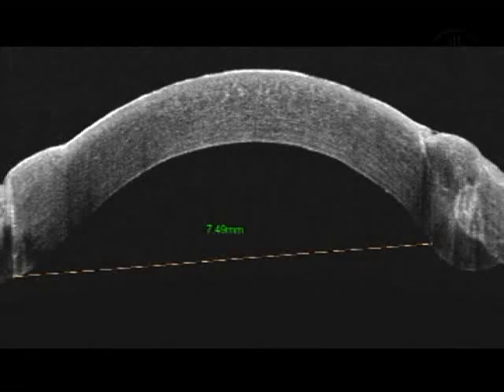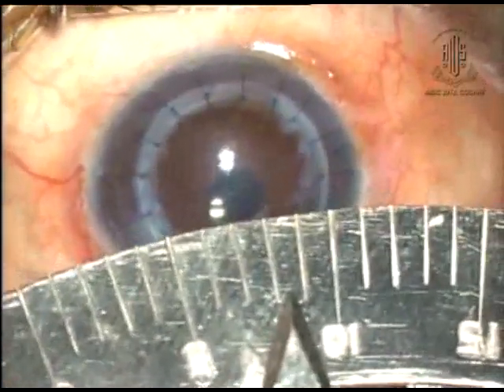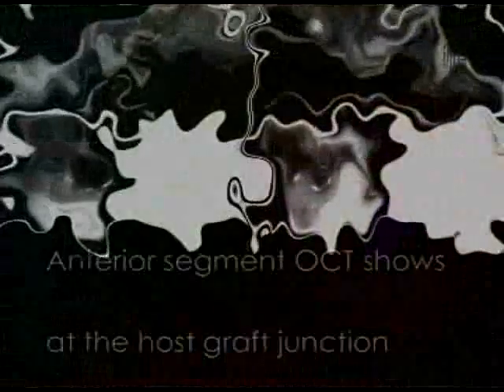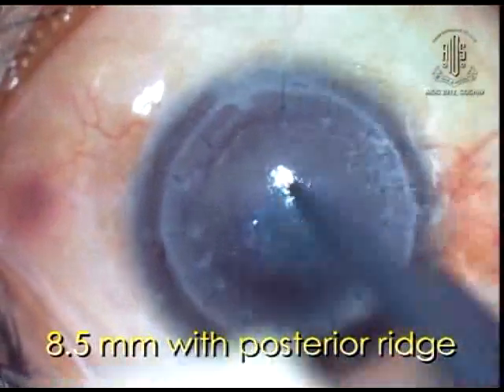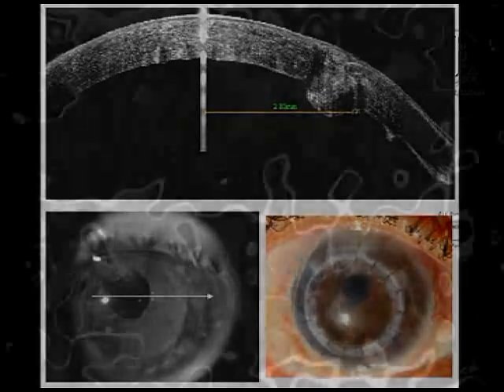With smooth posterior surface in OCT with a 7 or 7.5 mm previous graft, 1 mm larger donor tissue can be taken, and it is preferable. But if there is a posterior ridge detected by OCT, irrespective of graft size, then a smaller donor is preferable. Otherwise, dislocation may occur. Even with smaller graft, if the donor edge crosses the ridge, there is also a chance of donor dislocation.